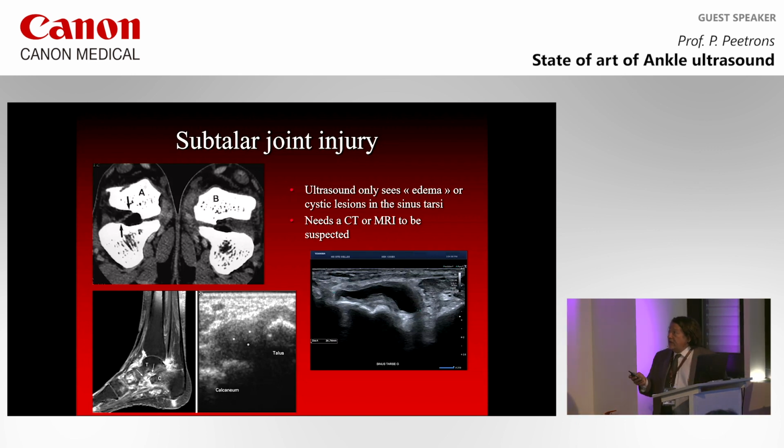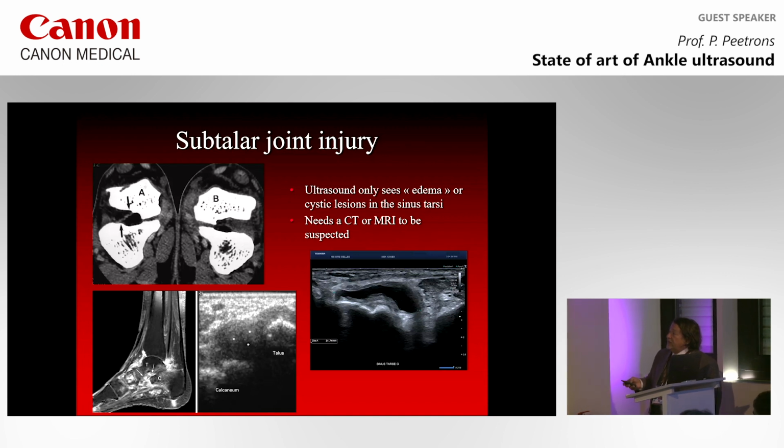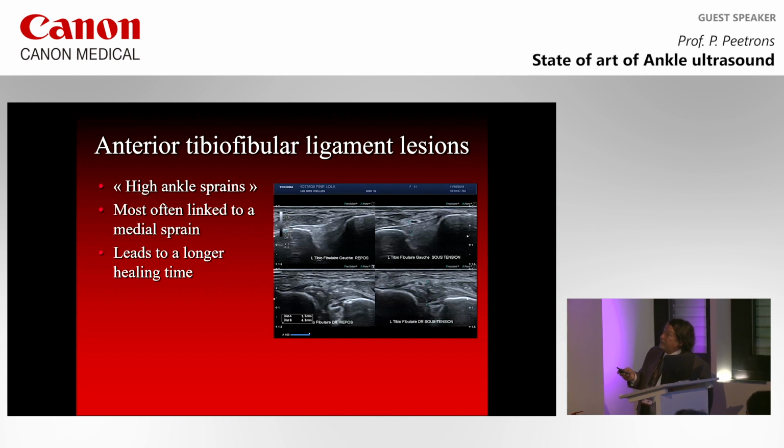Subtalar joint injury is sometimes difficult to see with ultrasound because we can only see edema coming from the subtalar joint, and this is much more seen in MRI than in ultrasound. Or we can see some cysts coming from the sinus tarsi, but sometimes, I'm sorry, we need MRI or CT to be sure. I didn't tell you about the anterior tibiofibular ligament lesion.